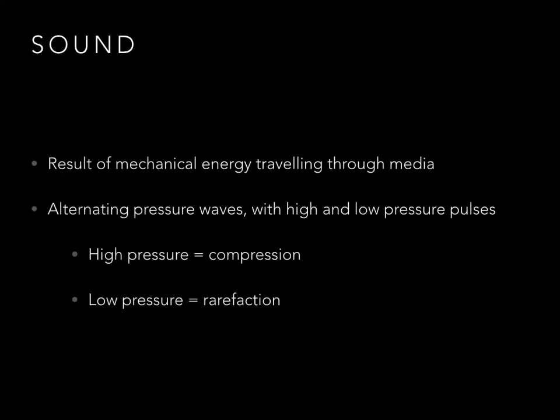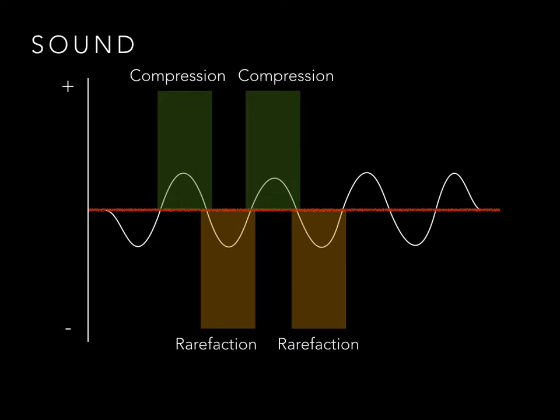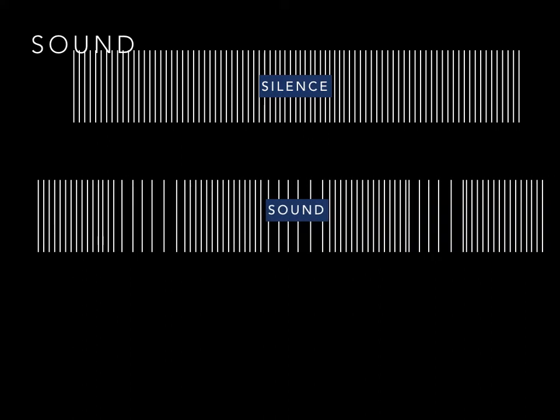Sound is mechanical energy that is propagated through a medium by the vibration of molecules. This vibration will make the molecules oscillate about their resting position. Propagation occurs in the longitudinal direction. Zones of high pressure, called compression, and low pressure, called rarefaction, are alternating, creating a sinusoidal waveform. Sound waves propagate or travel through media by interacting with particles, so sound waves cannot travel in vacuum.